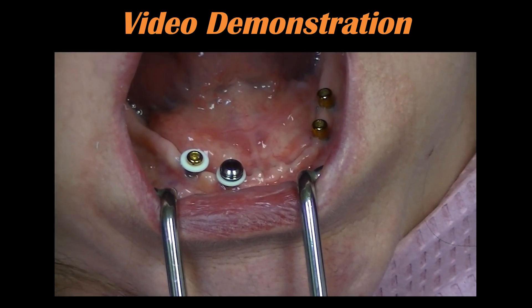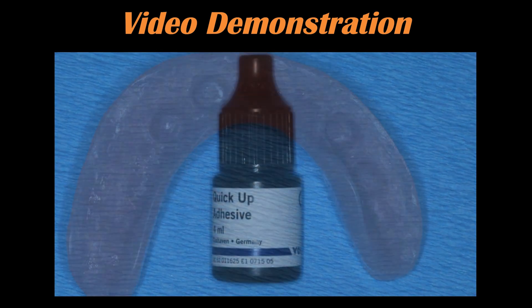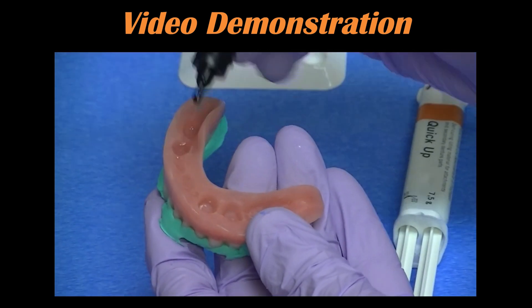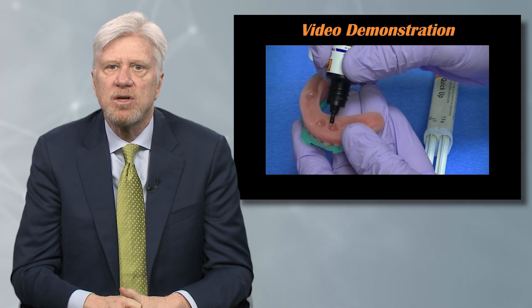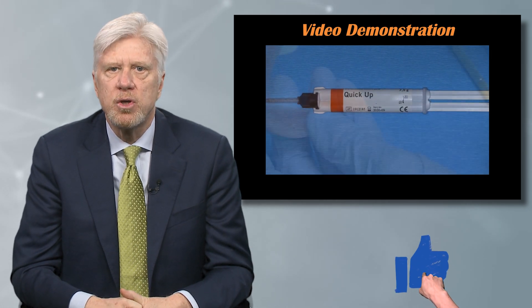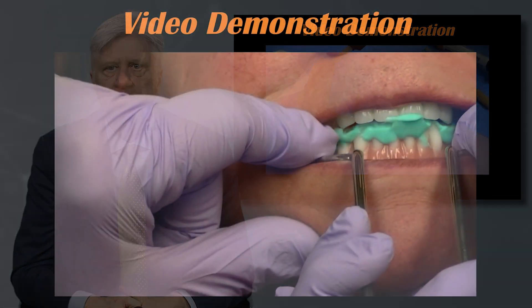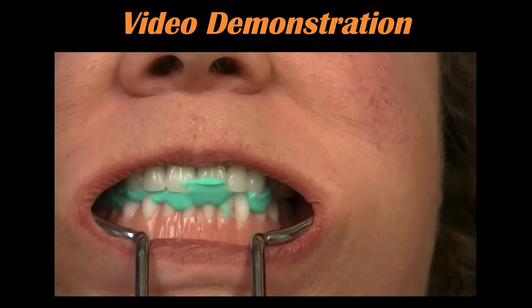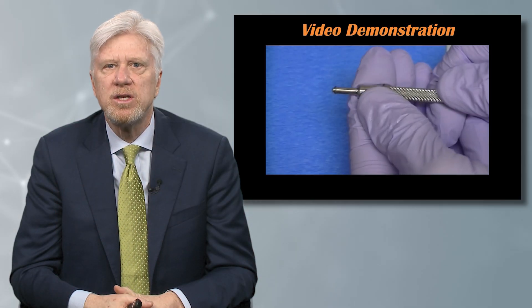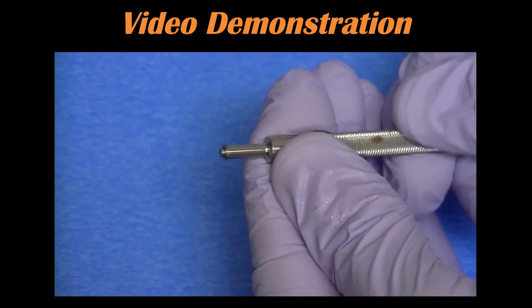You know 100% that those are completely seated. You can see our overdenture — we've relieved it. We're going to put our QuickUp adhesive material and drip some into each of the receptacles, then dry that. We take our QuickUp dual-cure material and fill each receptacle about two-thirds of the way up, pressing firmly. Allow the patient to function into our bite relation. Everything's polished, and then we insert the final locator attachments using our inserting tool.